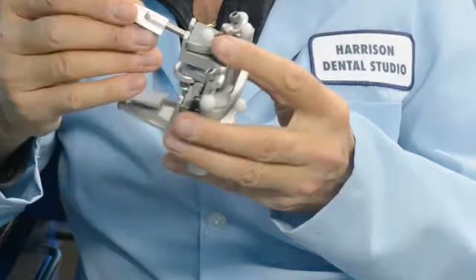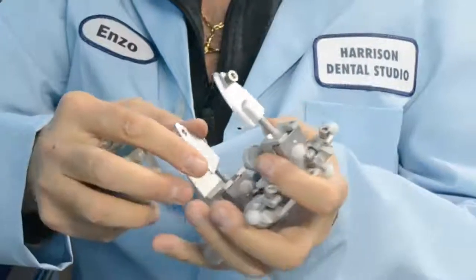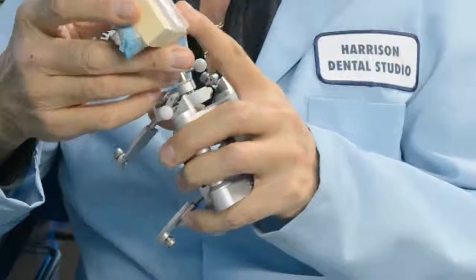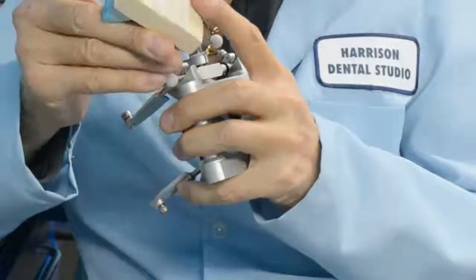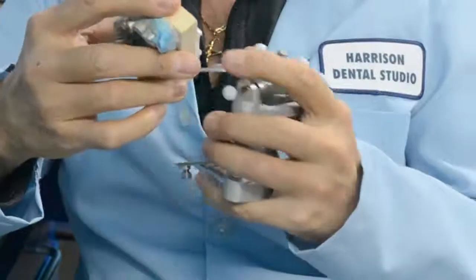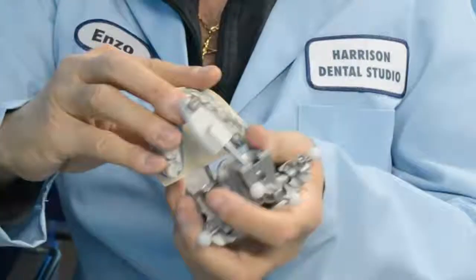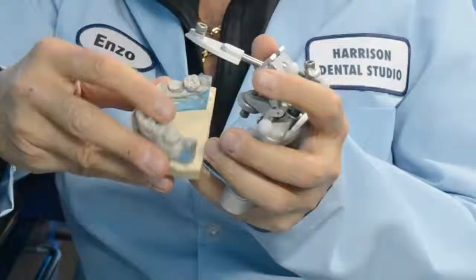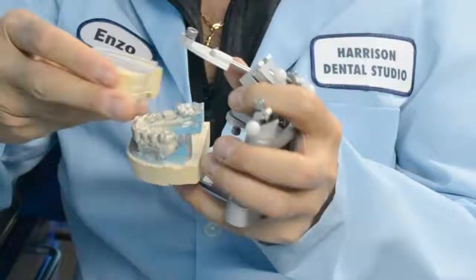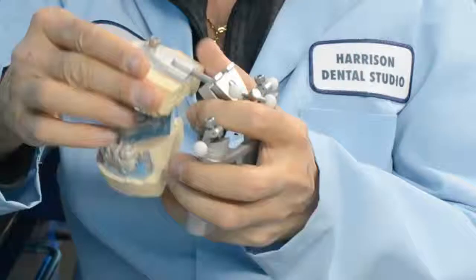The Enzo Articulator works on ball joints that swivel 360 degrees. It's very simple. To articulate, it calls for a plastic female that gets glued onto the model. You score the model, then glue it onto the disposable plastic female, then slip the mounted model onto the male, onto the articulator. As long as you're able to glue the disposable plastic to the surface, you can articulate it. The Enzo Articulator will articulate anything from the smallest model to the largest model.